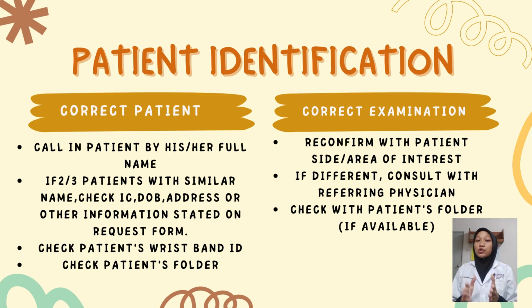Second, we must make sure it is the correct examination. We can reconfirm with the patient the site or area of interest. If different, we must consult with the referring physician, or we can check the patient folder if available.